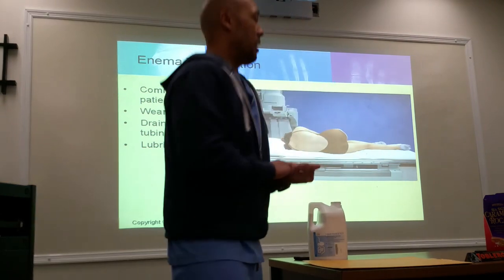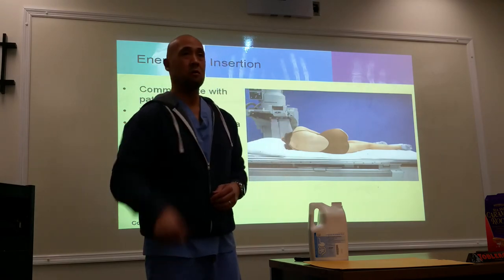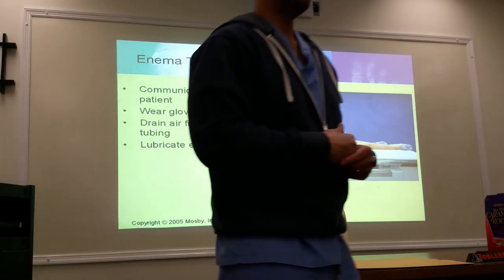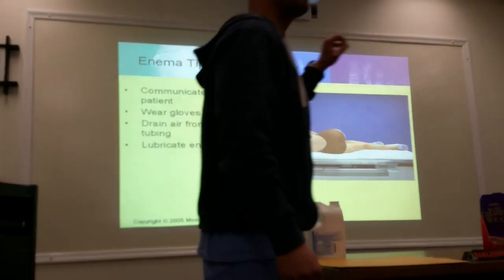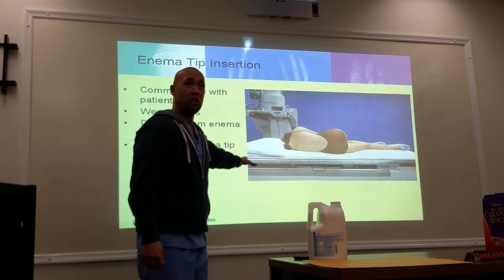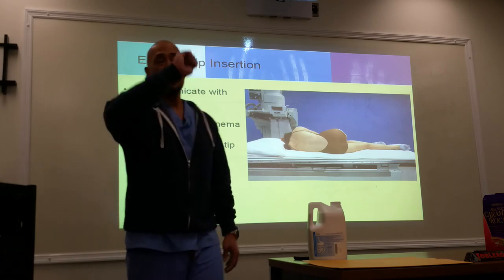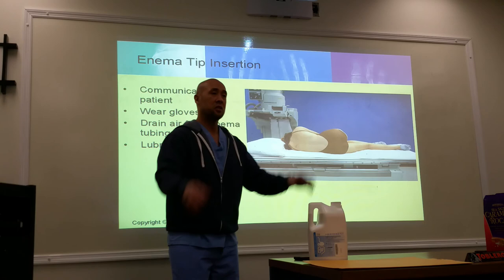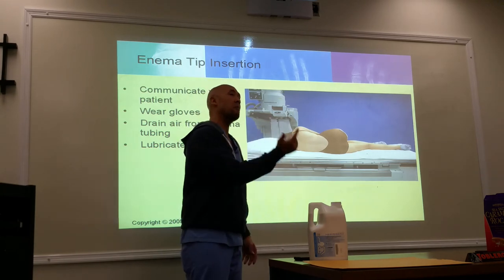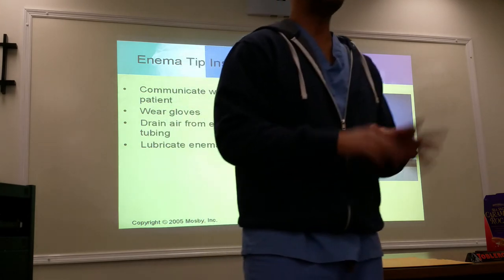And then I say, okay, here's the gown. Go to the room. Opening goes on the back side. They come back out, after they've removed everything, I'm going to put them on the table and shoot my KUB. It's just going to be a regular KUB. Show the image to the physician. The doctor says, okay, go ahead and set them up. Then I'm going to go back in the room, and now I'm going to do the explanation of the procedure. That's one way of doing it.